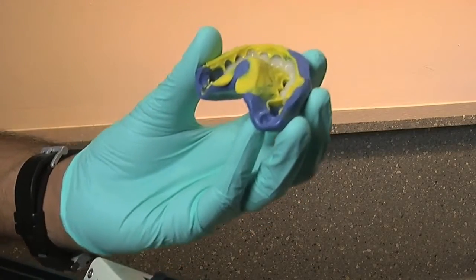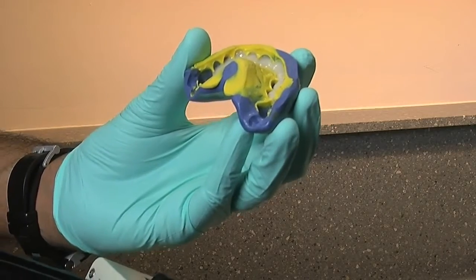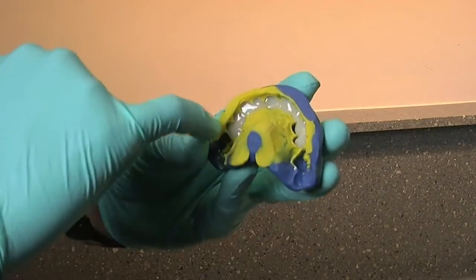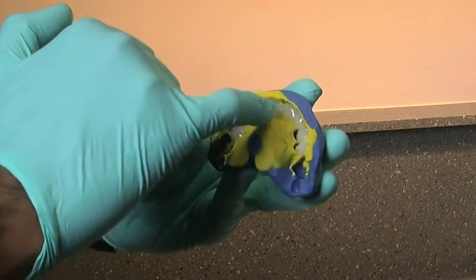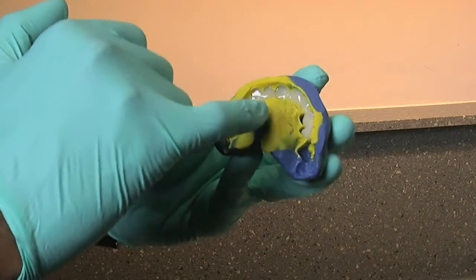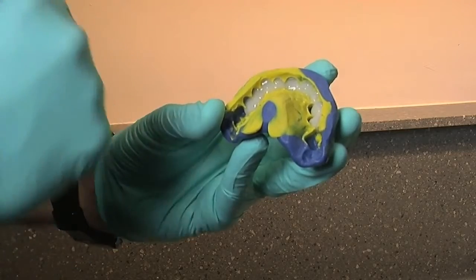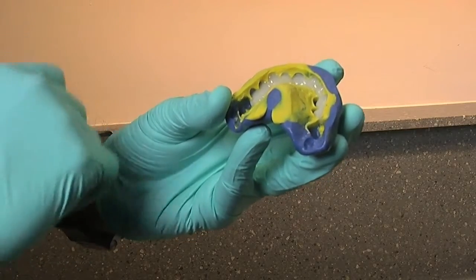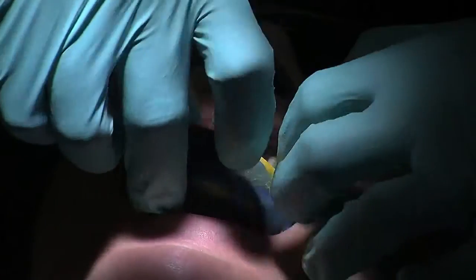This would then be introduced into the mouth and seated very firmly. And after 2.5-3 minutes, you take it out. Notice we've got good palatal reference against the palate, so that we get a very positive stop and you get no distortion anteriorly, so the flash is very thin. And then I'm going to bring it back into the mouth.